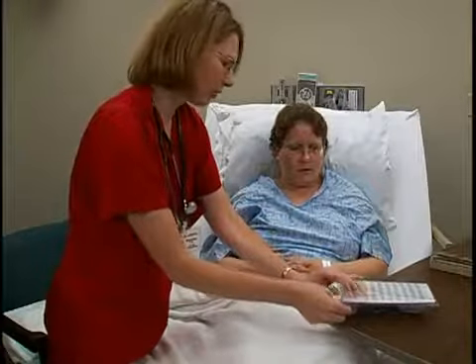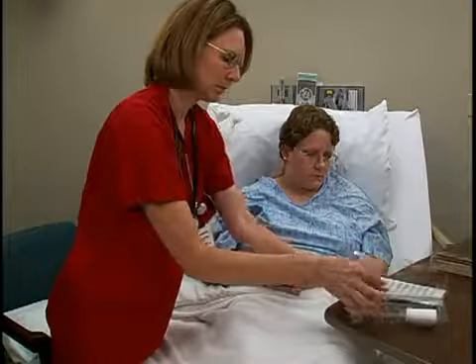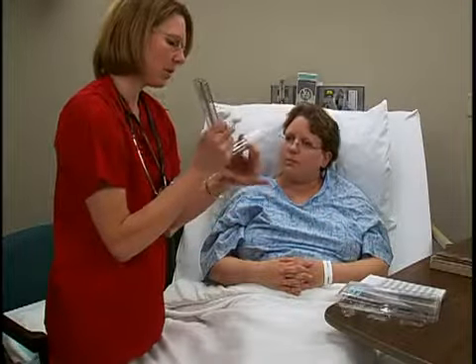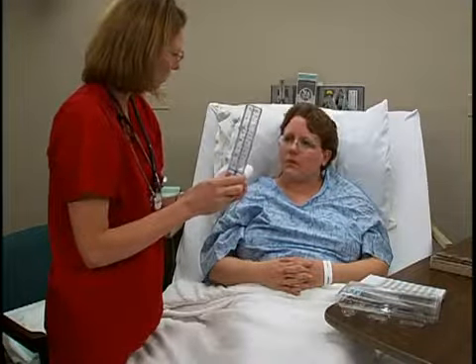This is a peak flow meter. We're going to check to see how your lungs are doing. Then slide the mouthpiece into the base of the numbered scale. I'm going to stick it on here for you. What we're going to do is try to shoot for the top. Instruct the patient to take a deep breath. I want you to blow as hard and as fast as you can. Okay? One time.